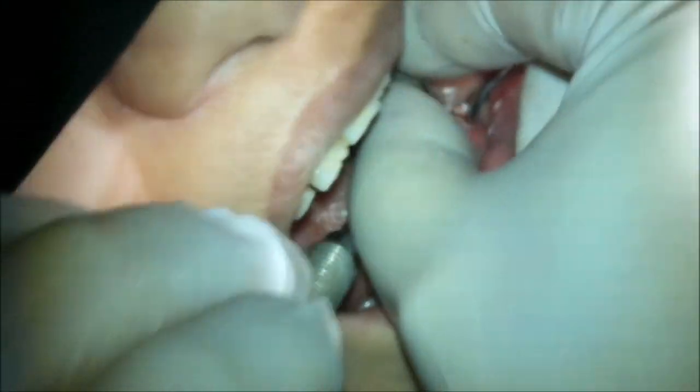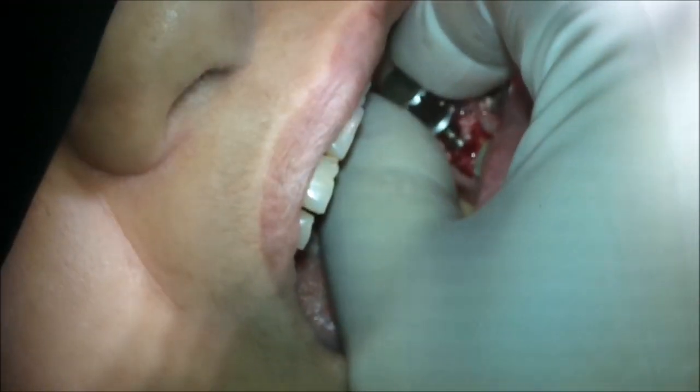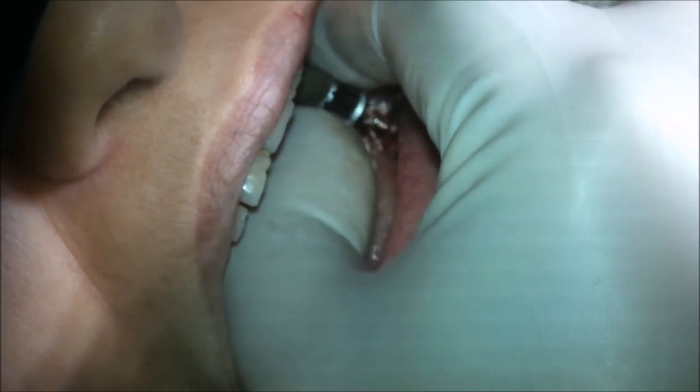After that, we remove the cover screw, put the membrane in place, and reinsert the cover screw again to fix the membrane in place.